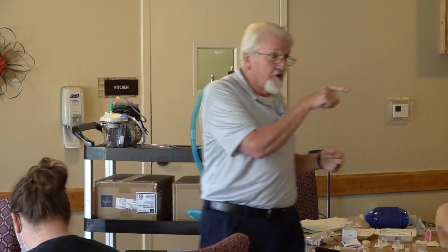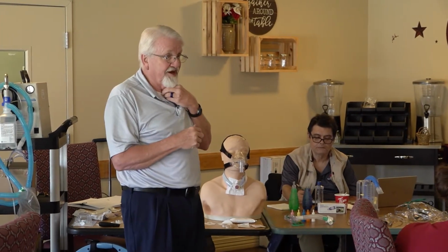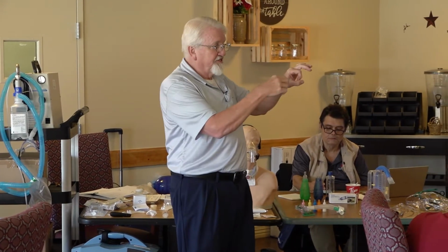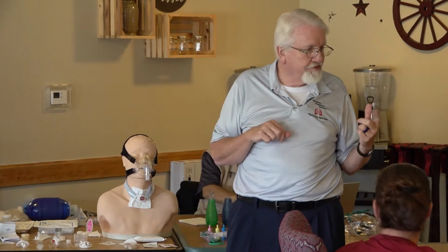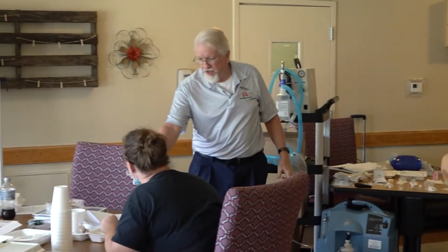Some may want to wear the Lary tube, and as you can see, it's just a protective device that will go into the stoma. You'll notice the angle of it is about 45 degrees, so it's designed to seat right against the stoma, and you see the 2 butterfly tabs on the sides. It uses the same trach collar as a tracheostomy does. Big difference is, when I say seat, it just seats just like that. No gauze or nothing like that that you have to put behind it.